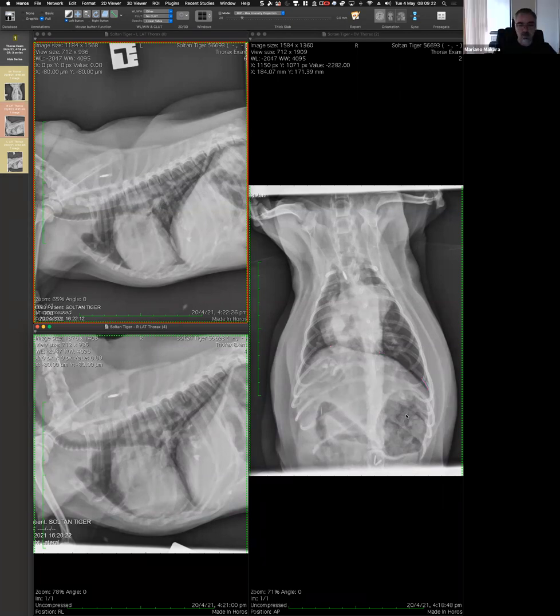Okay. Good. Well, that is an interesting point, and many times the relevance of findings, and this is what sometimes annoys people, is not based on how big they are. Makes sense? Pneumothorax is one, but also pleural effusion, or a small nodule. They are very small findings, but if they are real, and if we can prove that they're real, we are not dealing with an artifact.